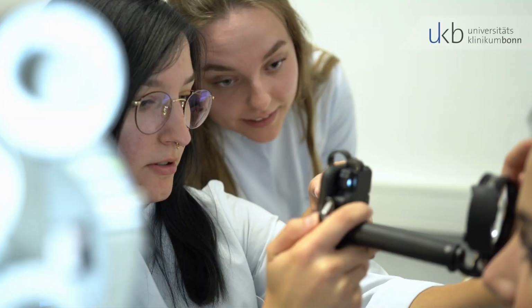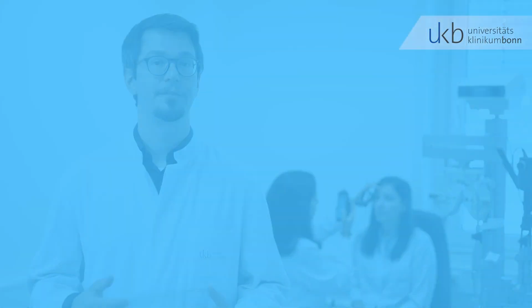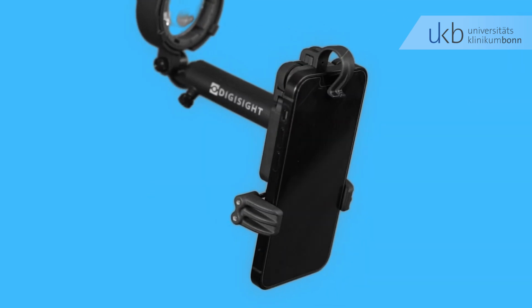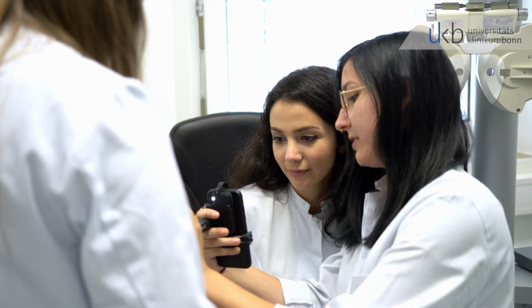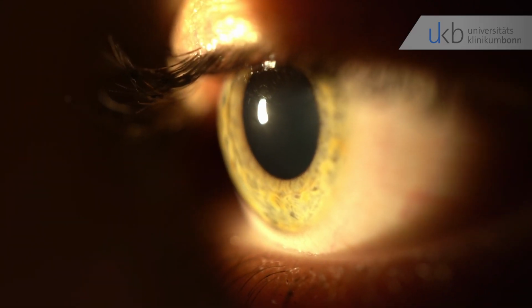What about the practical training? While watching the different modules, you will be asked to directly try out all explained steps on your own. Therefore, it is necessary to have all required equipment at your disposal. This includes the adapter and lens for smartphone-based fundus imaging, spectacle cloths for cleaning purposes, a smartphone with the latest version of the app, and a volunteer with dilated pupils. Make sure the pupils are sufficiently well dilated.